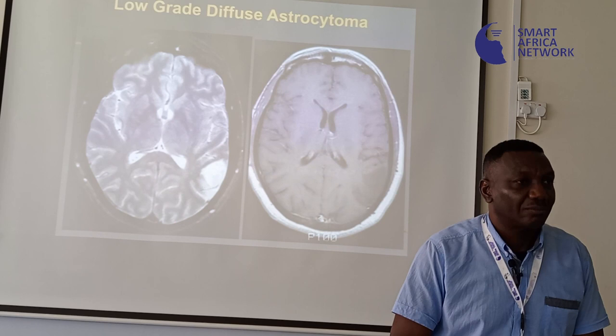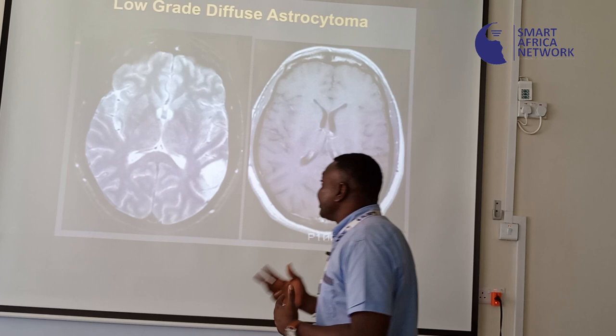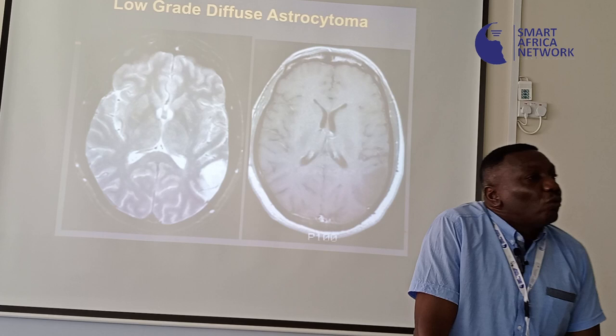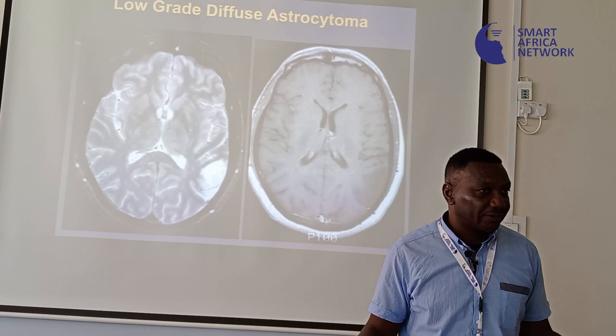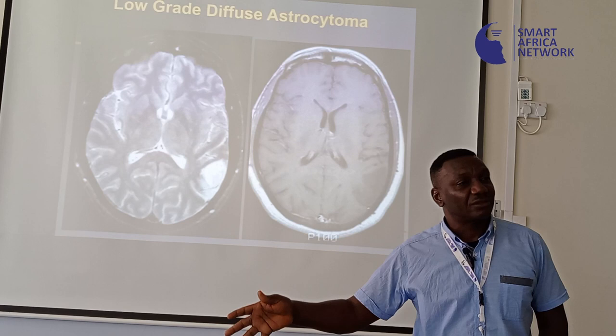Now, a T2 weighted image is also an image that is based on the timing that you pick your signal. On the T2 weighted image, the CSF will appear white. So that's how you know which sequence you're dealing with. Alright? Now, so usually T2 weighted image shows CSF as white, as the classic display.